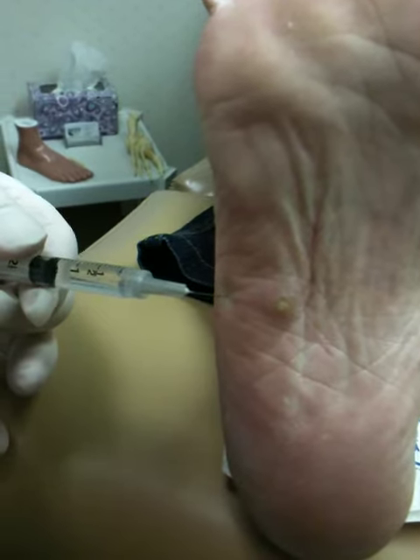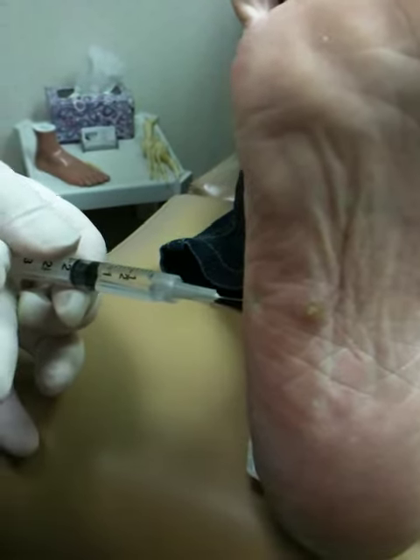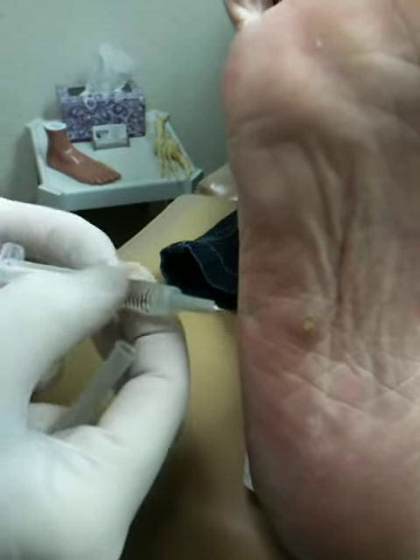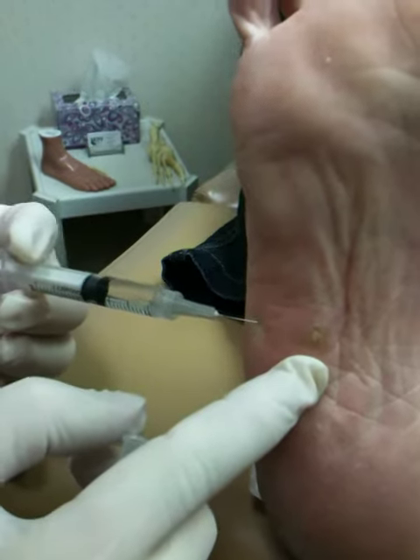So after this, you're still going to freeze it? Oh, no — we're not going to freeze it. We're going to actually remove it. Oh, I mean after it heals up. Only if it needs it. Hopefully this will do it.